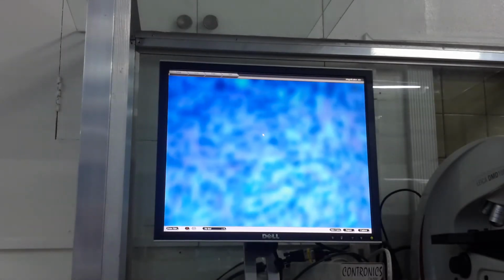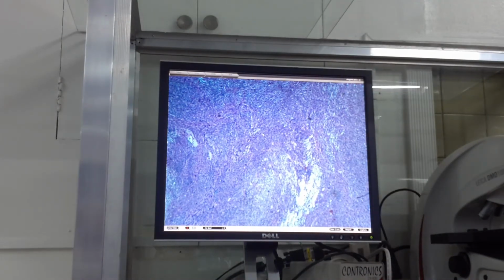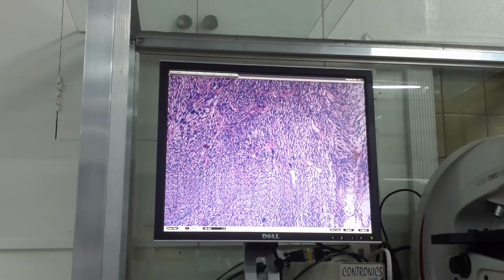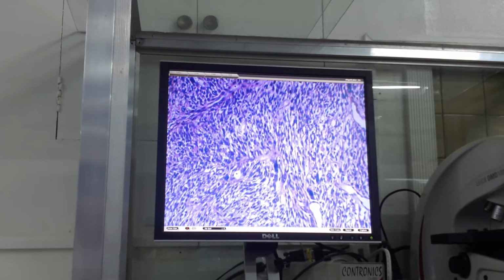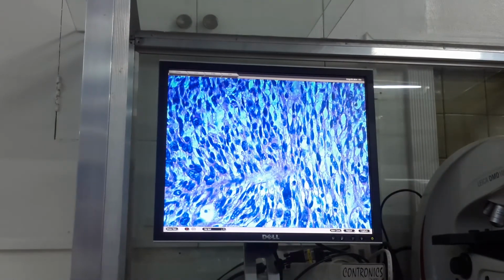So we have actually finished 3 slides. The third lesion, very characteristic pag lumabas sa practical exams. Benign or malignant? Benign or malignant? Malignant, di ba? Nuclear pleomorphism, hyperchromaticity. Di ba?